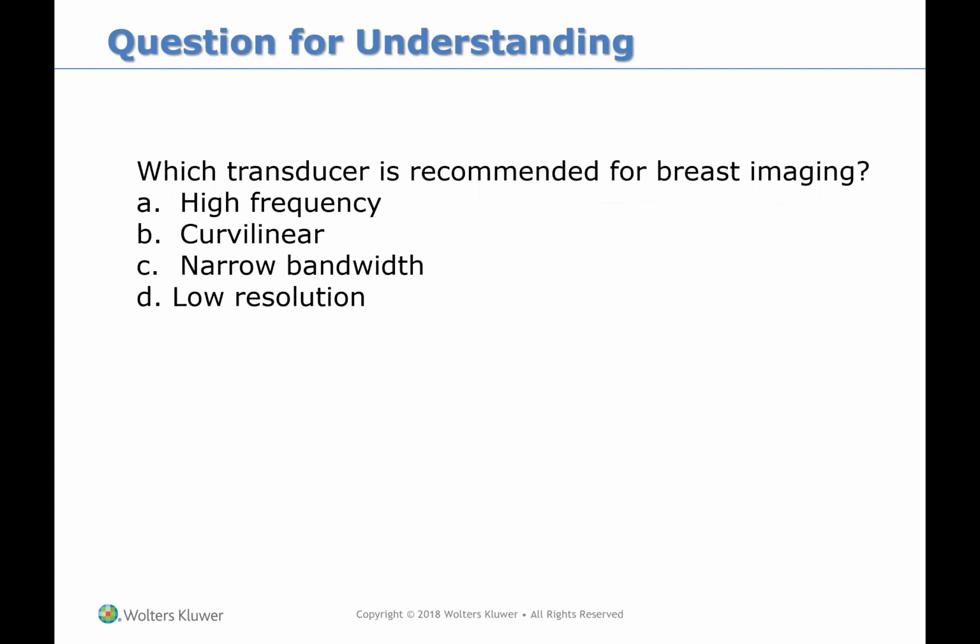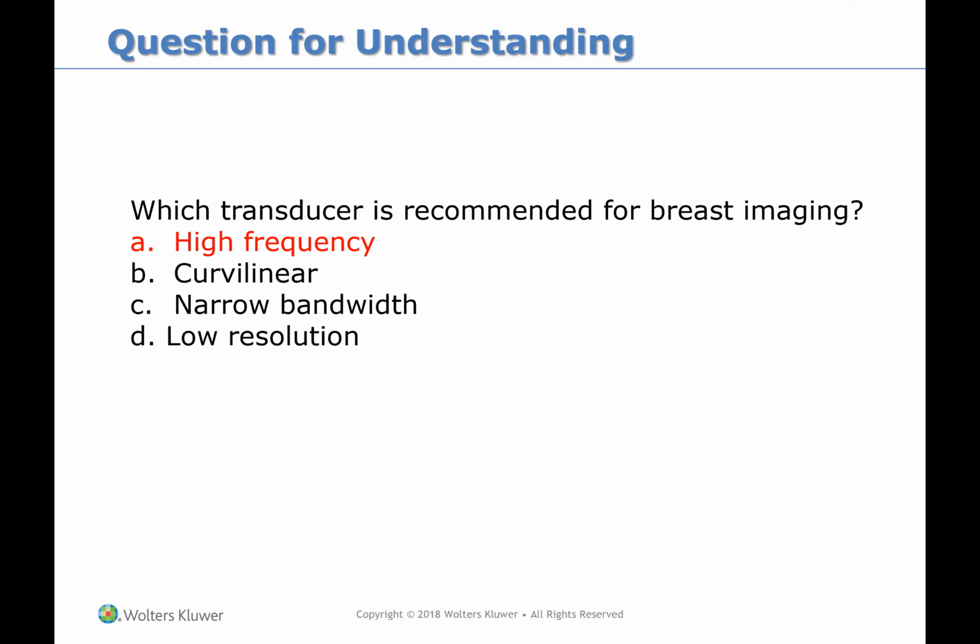Which transducer is recommended for breast imaging? Oh, I know this one, I think. It's a high frequency. Yes.